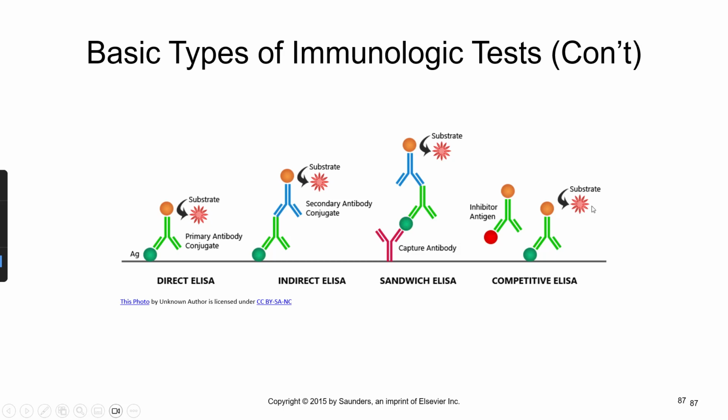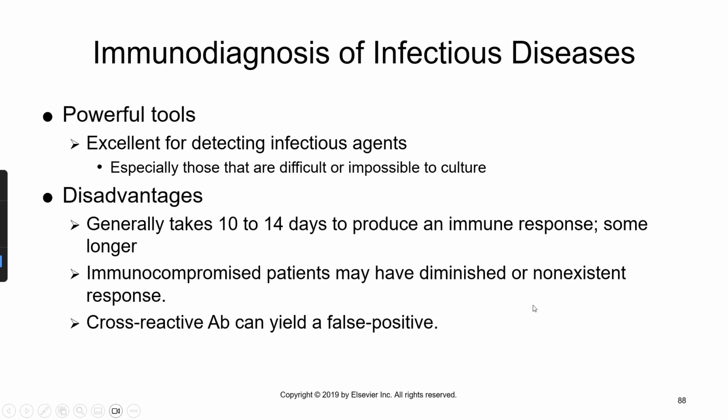We don't really use the competitive ELISA too much in clinical practice. So we're going to focus on these guys here, and we will be performing an ELISA once we get to our basic immunology course. So you can look for actually being able to perform these in that course.